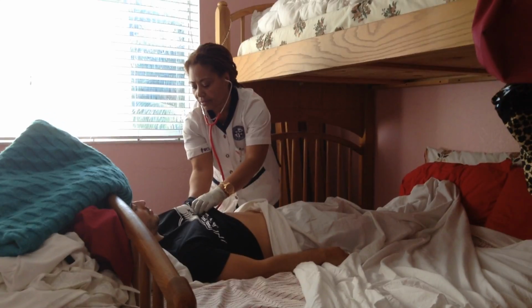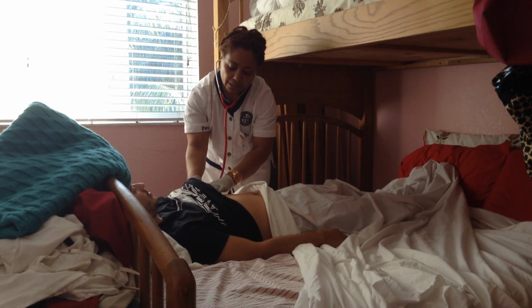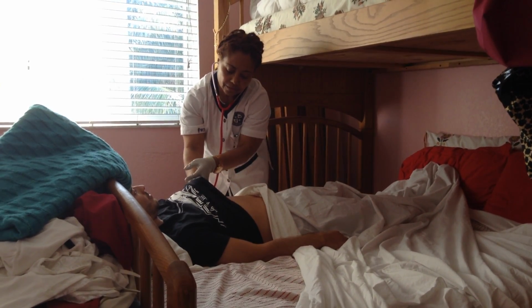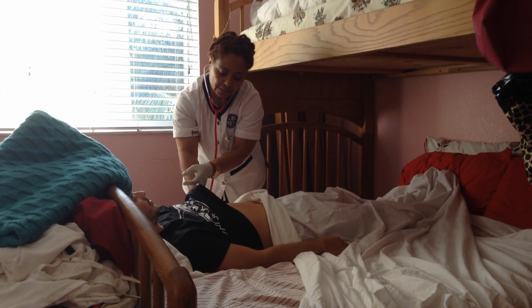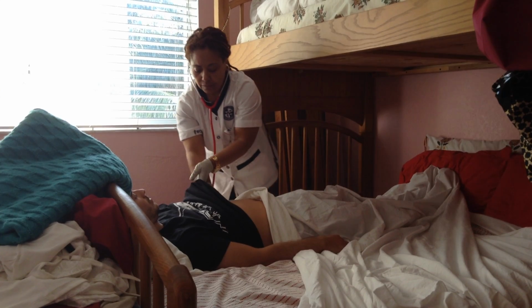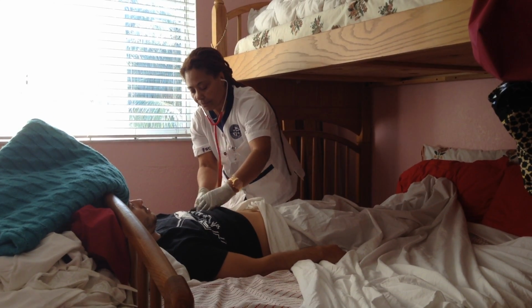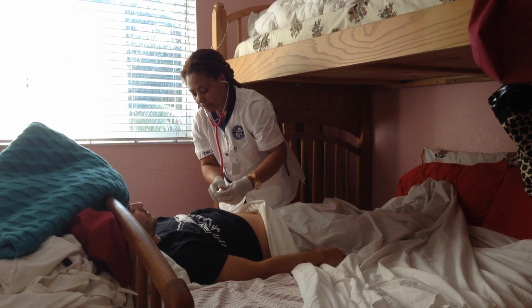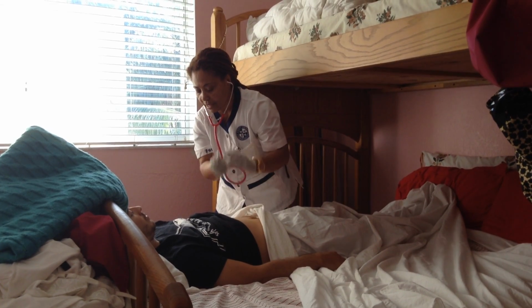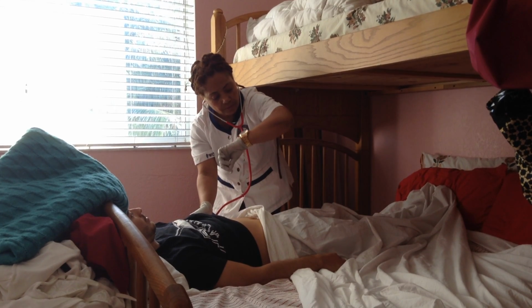On the left side is pulmonic, second intercostal, third intercostal is Erb's point, fourth intercostal is tricuspid by the sternum border, fifth intercostal mid clavicle is the mitral. I will listen with the diaphragm and bell, and I will listen for a whole minute.